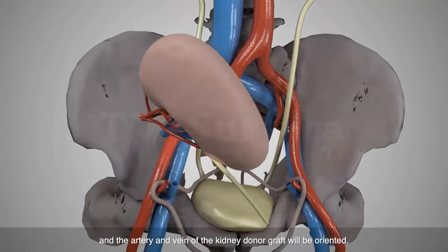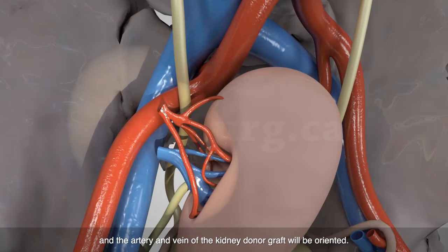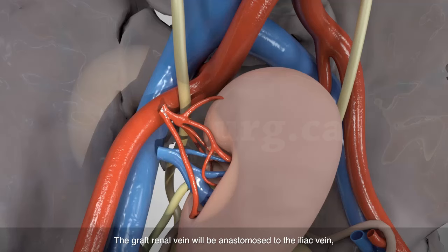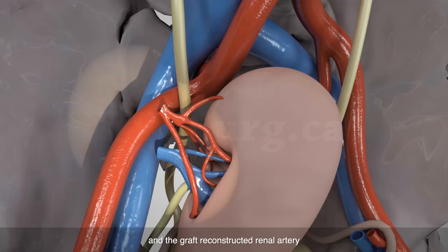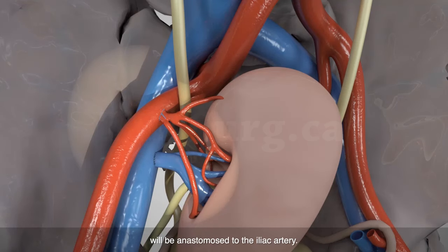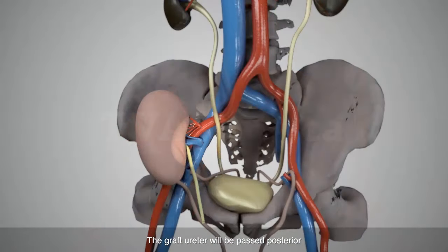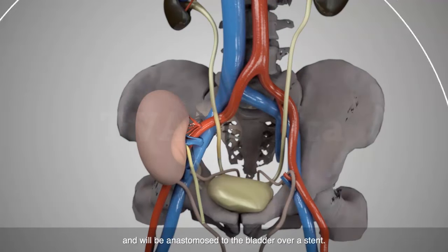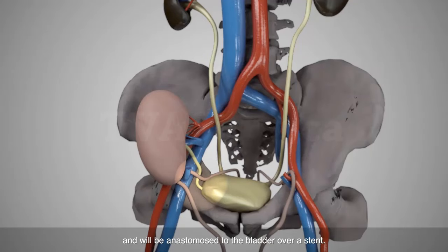The artery and vein of the kidney donor graft will be oriented. The graft renal vein will be anastomosed to the iliac vein, and the graft-reconstructed renal artery will be anastomosed to the iliac artery. The graft ureter will be passed posterior to the recipient spermatic cord and will be anastomosed to the bladder over a stent.